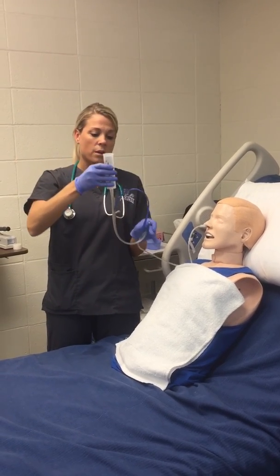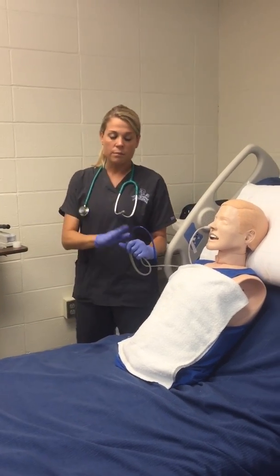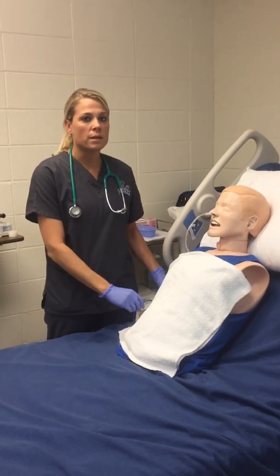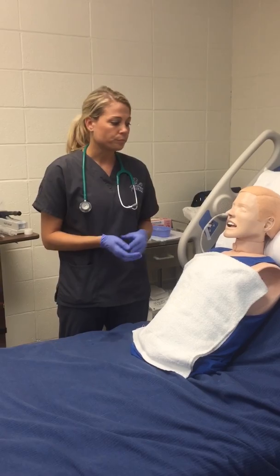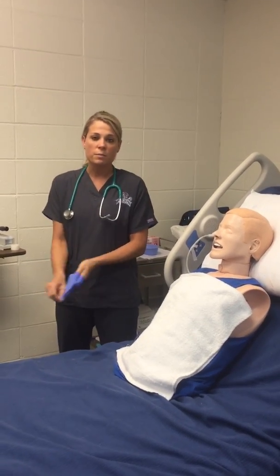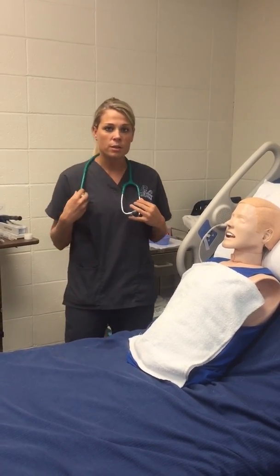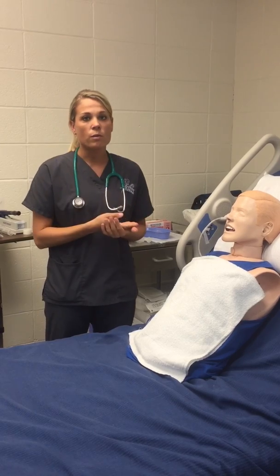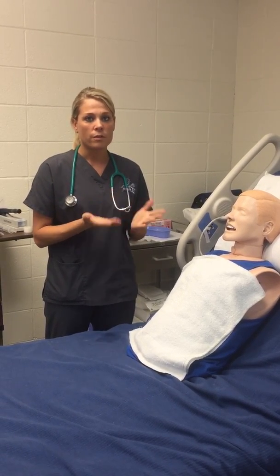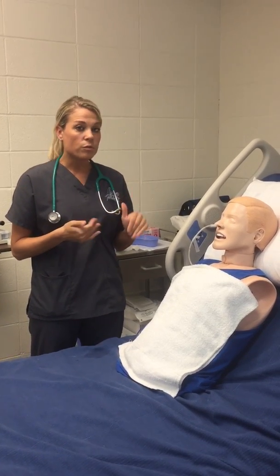Okay, we're going to go ahead and clamp it off again. Take our piston syringe off and just clamp the NG tube for now, because we don't want to hook it up to suction for at least another 30 minutes after instilling the medication. Once I am finished with that, I'm going to take off my gloves, wash my hands, make sure the patient is doing okay after administering the medication, and then document what we administered, the time, how much, and all that. So the last part of the video, we're going to demonstrate removing the NG tube.